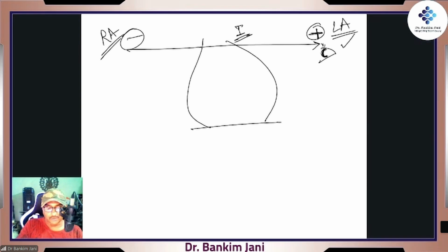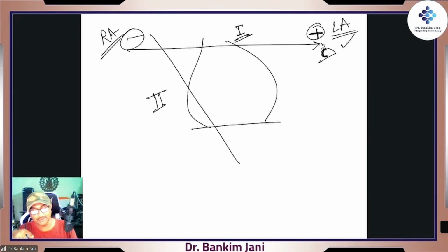So when I draw lead 2, from where am I watching the heart, or which part of the heart am I watching, from whatever we discussed till this point? Right side. Okay. I'll not say whether you are right or wrong.